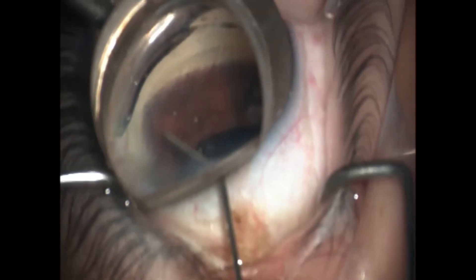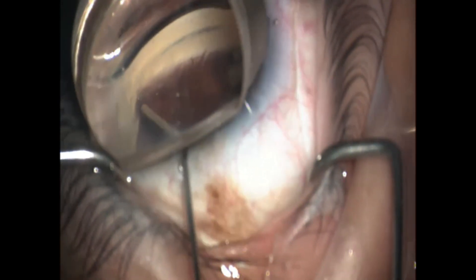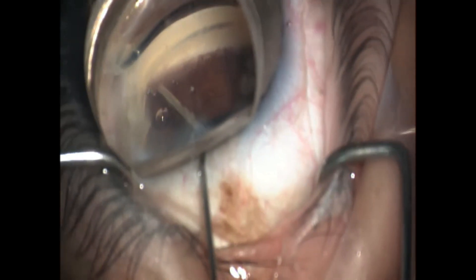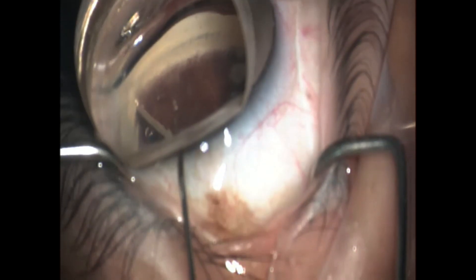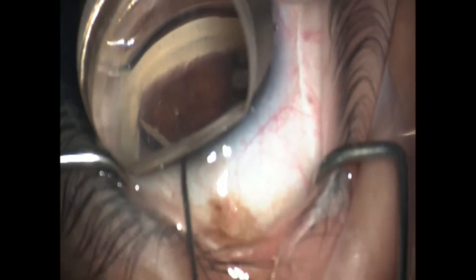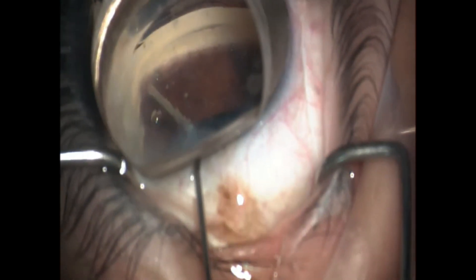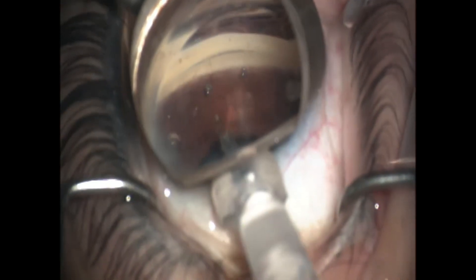So here I'm sticking in the visco cannula and I'm just pushing a little bit of visco in the area to clear up my view. The second I do that, I see the stent rotate — so I know this one has not been implanted correctly. The first thing I try to do is use the tip of that viscoelastic injector to try to push that stent into the meshwork. If that doesn't work, I float that stent into a better position where I can see it a little easier, and then I insert the iStent injector and use the trocar on the injector to actually pick up the stent.